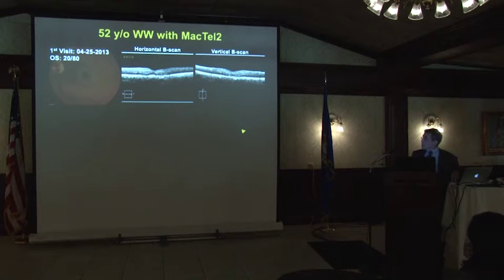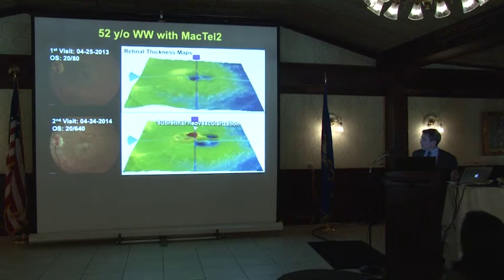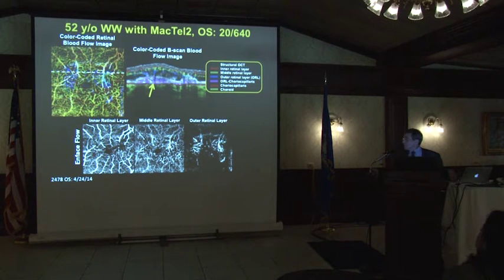Right. So here's the patient in 2013, comes in a year later. We get increased thickening here. There's neovascularization under the retina. There's the thickening on the OCT macular thickness map. Okay. The retina doesn't show much, just a lot of distorted vessels, anastomoses deep into the retina, but no neovascularization. But there's the neovascularization right there, colored pink. Pink is under the RPE into the choriocapillaris.